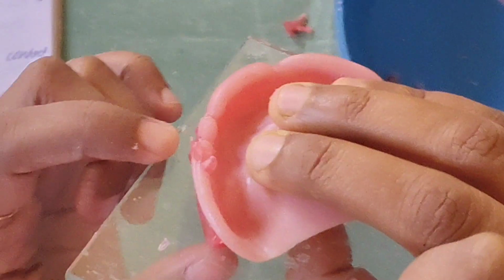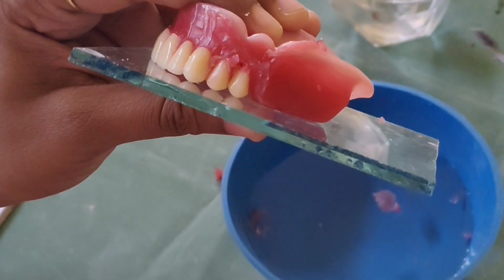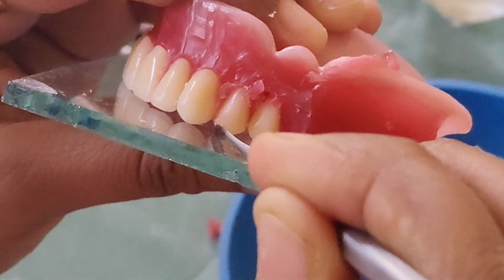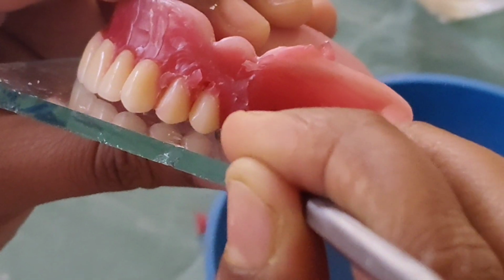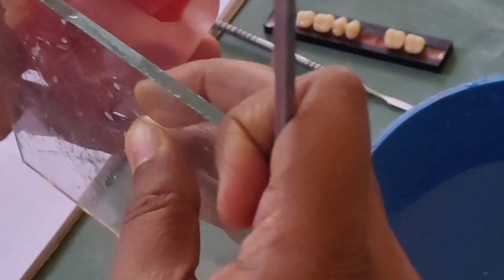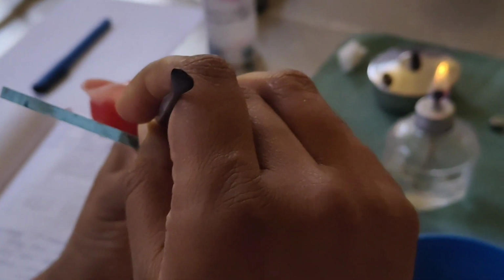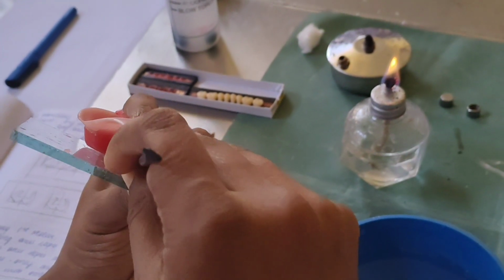See what I am seeing, this is straight, okay. Glass plate relation, the buccal cusp will touch. For the second premolar, both the cusps will touch, buccal and palatal. If it is not touching, from posteriorly we can just place this and pull it downward.